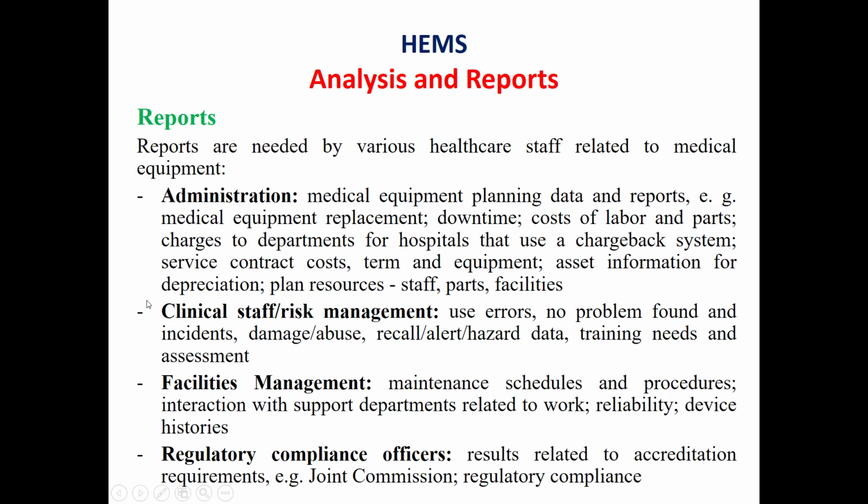We have other types of reports related to the clinical staff, risk management, facilities management, and regulatory compliance officers. In the case of the administration, we have reports related to medical equipment replacement, downtime, the cost of labor and parts, charges to the departments for hospitals that use a chargeback system, and so on.